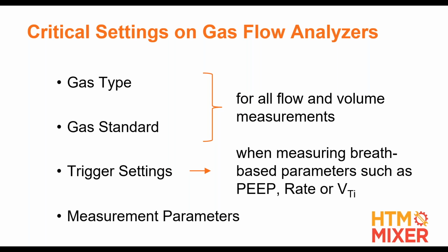And then, of course, you also have to make sure you're using the same unit of measure. Some manufacturers like centimeters of water. Is it centimeters or sonometers over here? Which one is it? East Coast, we're not far enough east yet, right? The further east you go, the more sonometers it turns into instead of centimeters. Potato, potato, right? Anyway, some people use hectopascals and some people use millibar. So it all depends on the ventilator manufacturer. Just make sure that you're comparing apples to apples all the time.